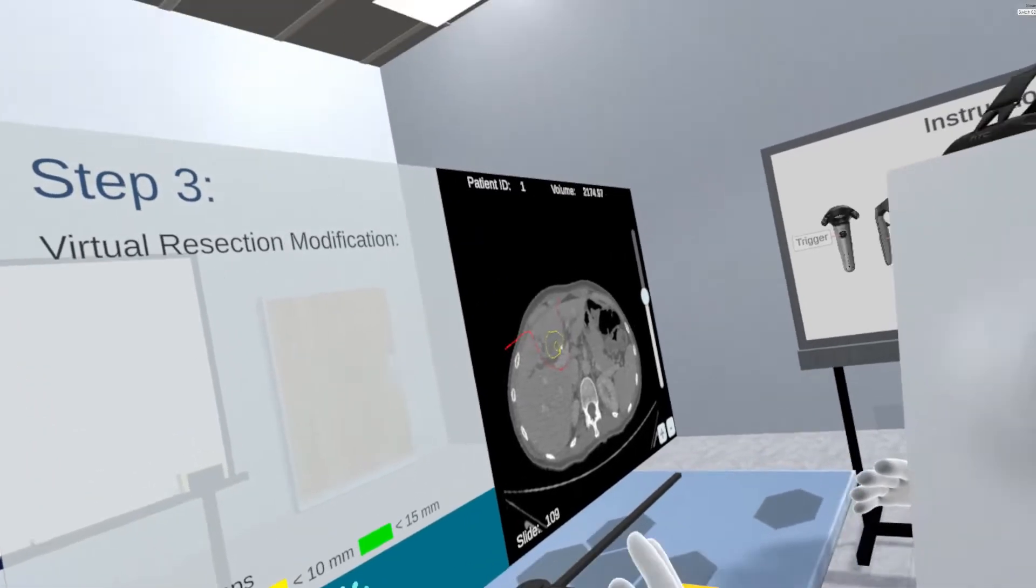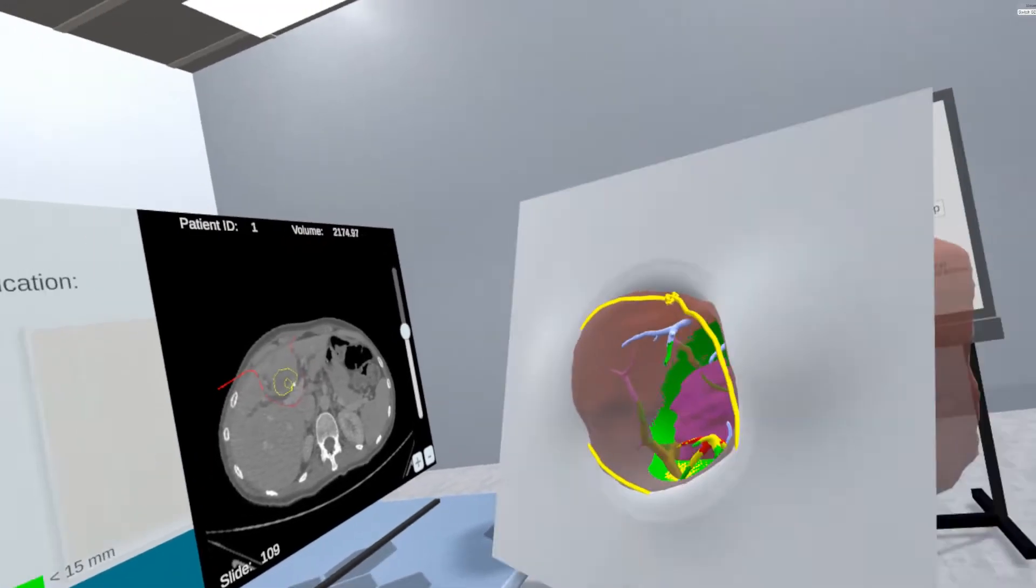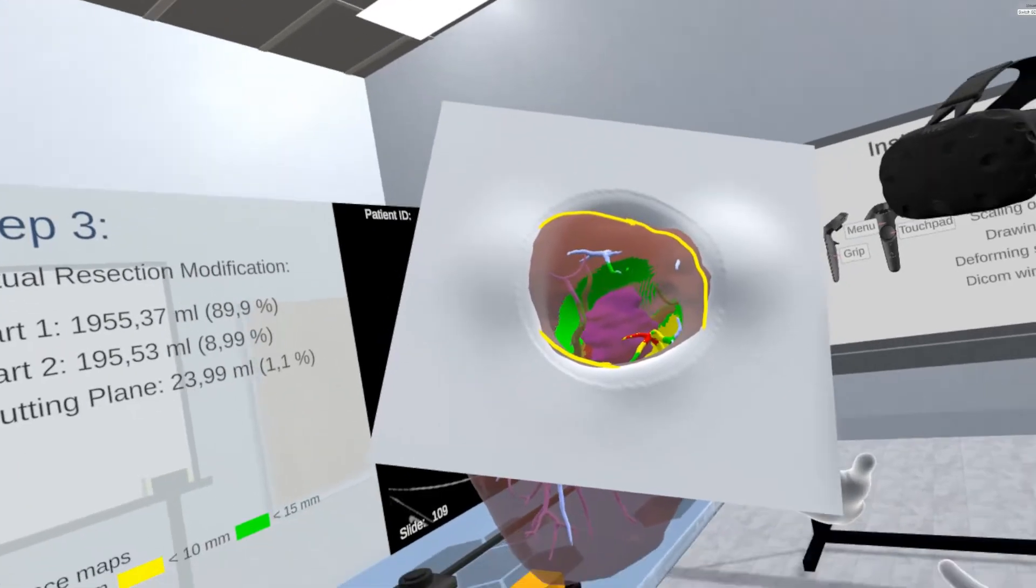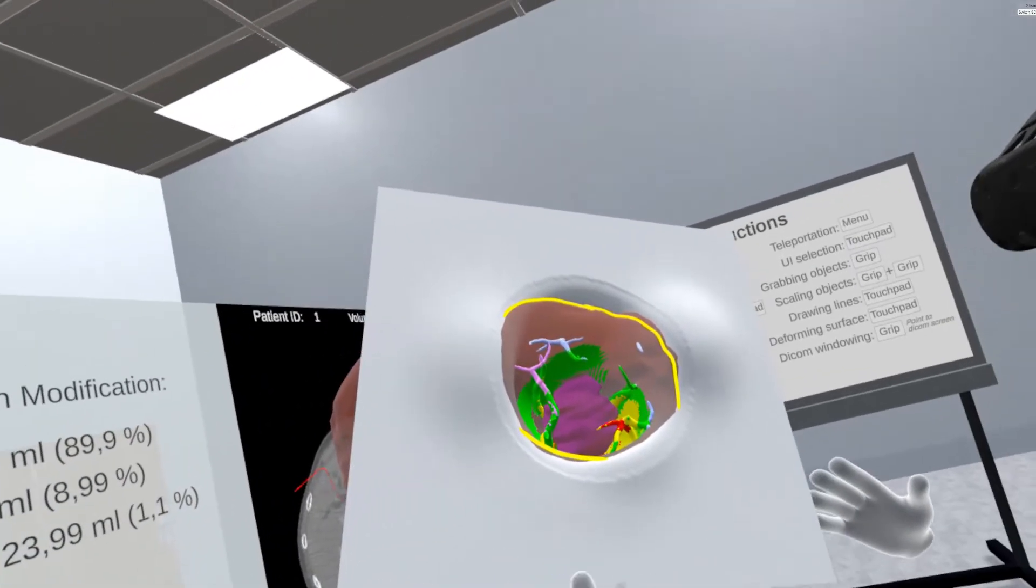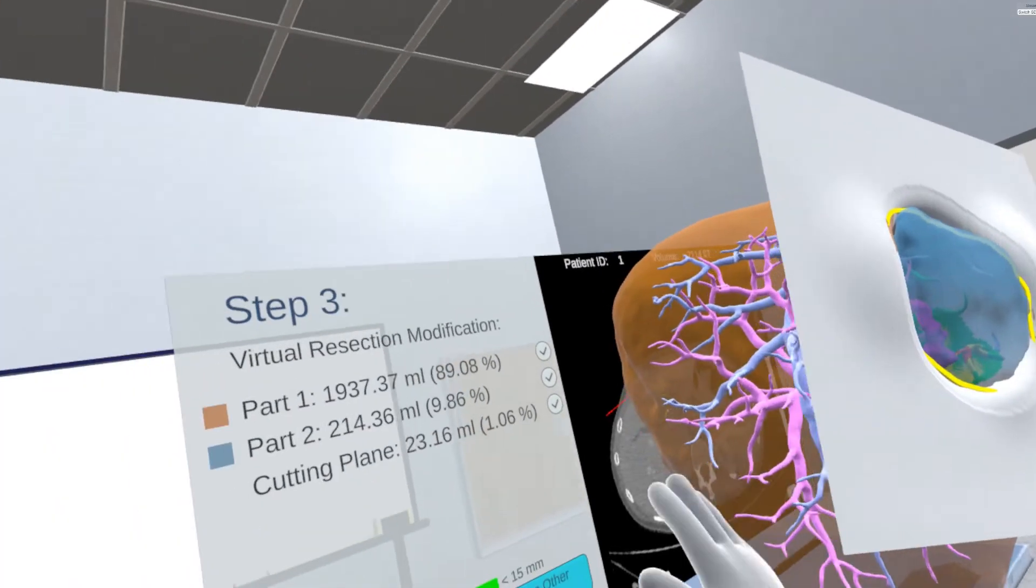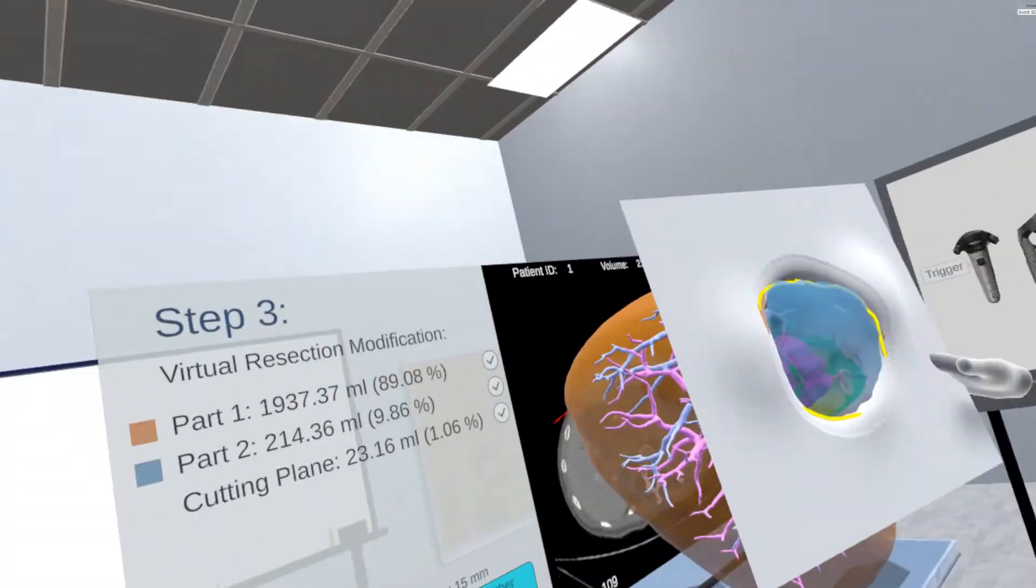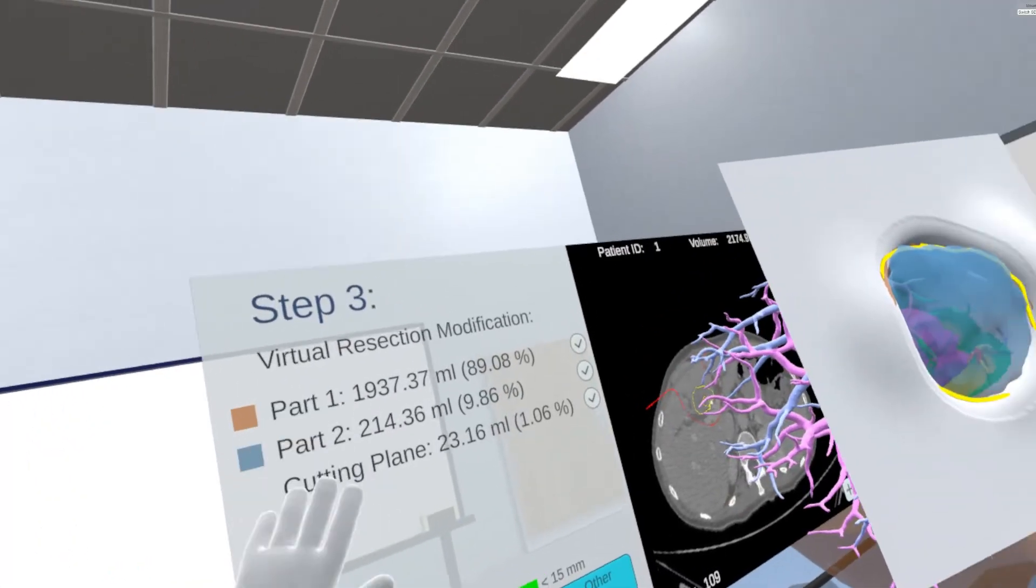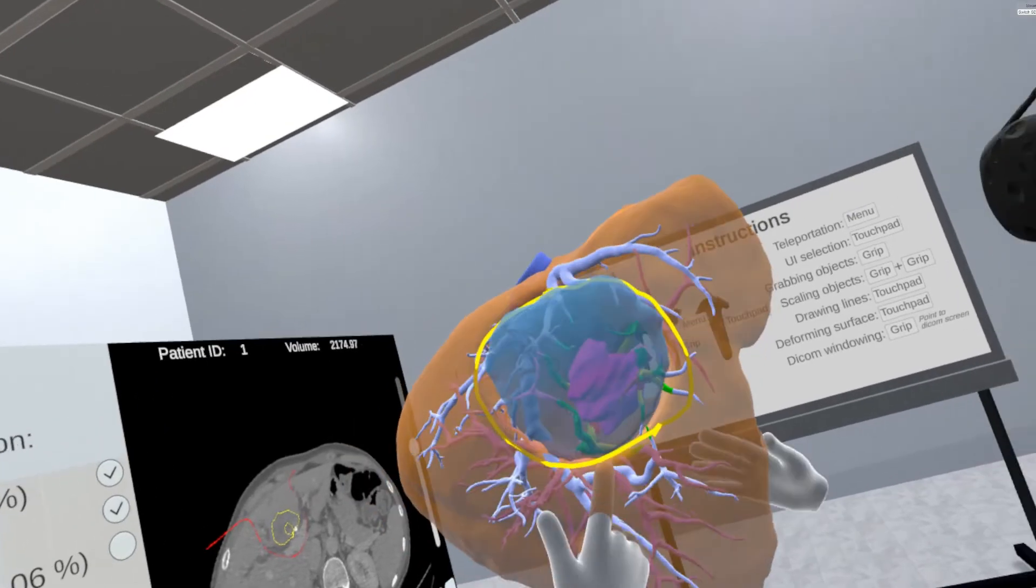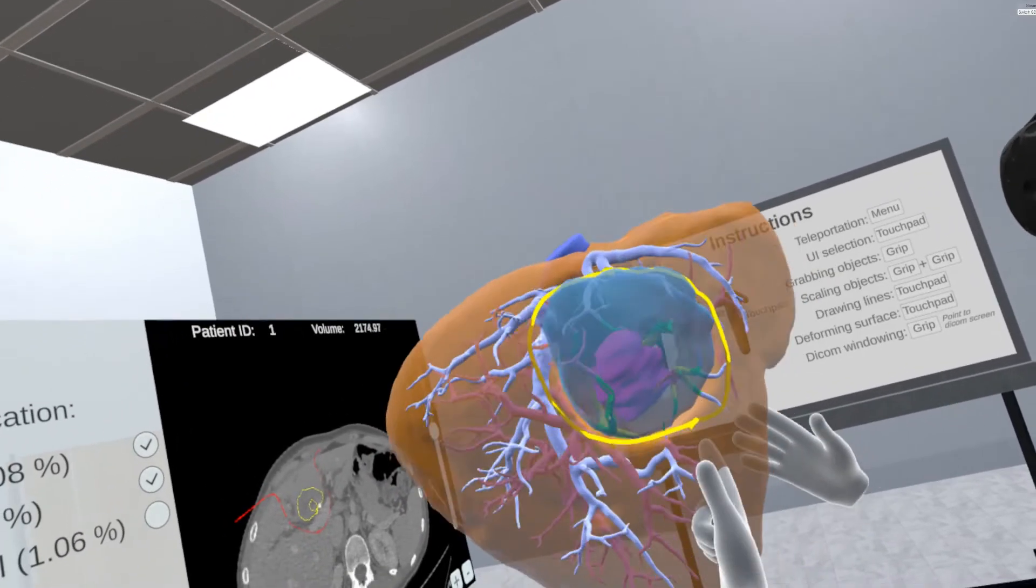After the users refine the resection surface, the planning procedure is achieved by a volume calculation of the resection and remaining parts of the organ. The planning results are visualized as resected volumes with their indicated amount and colors. The users can explore the individual resection parts and discuss the results. In cases of multiple tumors, they can add additional resection surfaces.